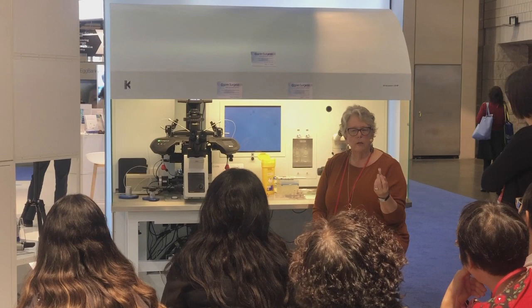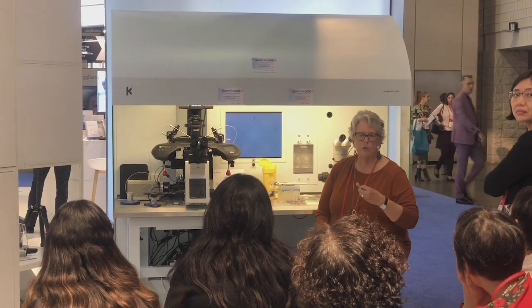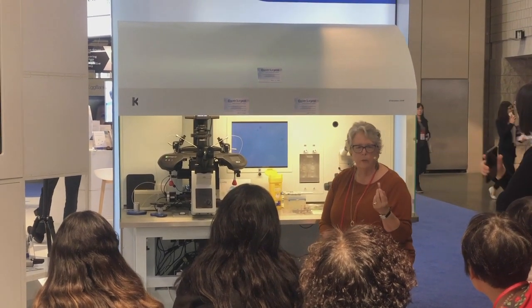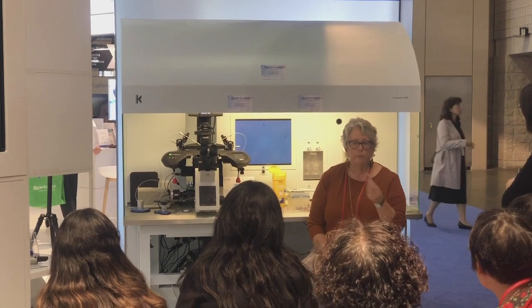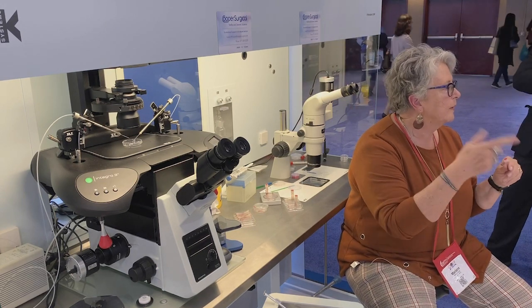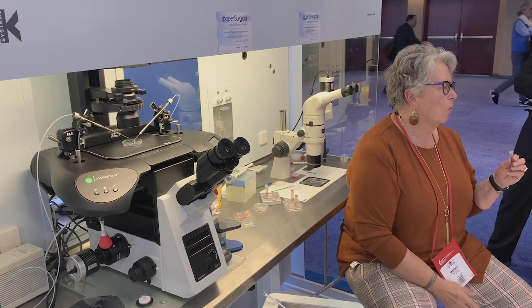Per patient. So in other words, if we have two patients to thaw and we're going to do one embryo per patient, I have one lab that transfers 1.09 embryos per patient, so we're pretty darn close to single embryo transfers. So it would be one tube per patient. We put them in a non-CO2 incubator the night before, so we let it get really nice and warm overnight.